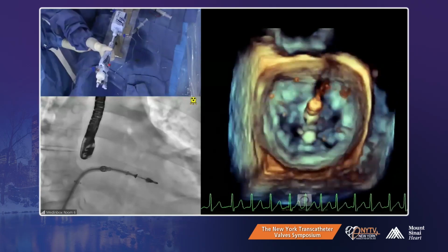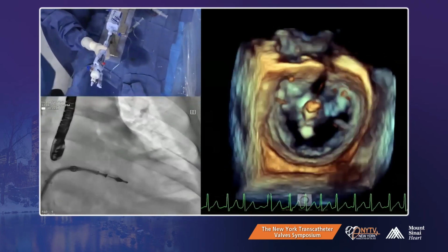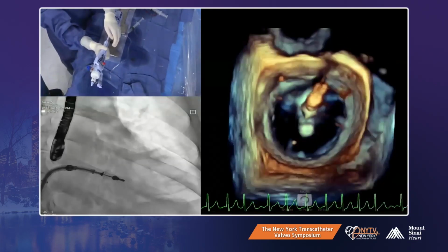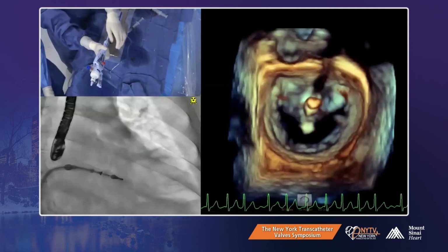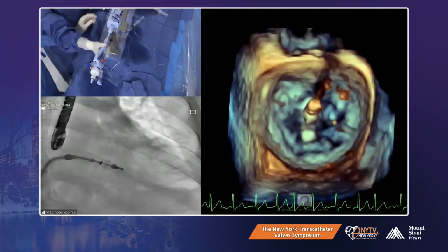So we take the parallax out, the clip arms at the same time. And you remember, there's a paper by Gagan Singh and Jason Rogers group on CCI that basically used that as well to make sure the clip doesn't rotate as we go into the ventricle. So, Stam, you think we are right or a little medial? You are in the middle now.